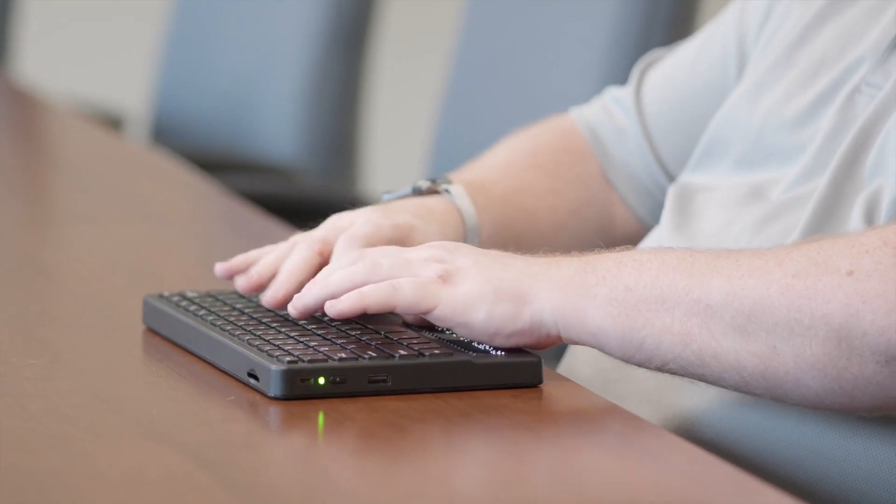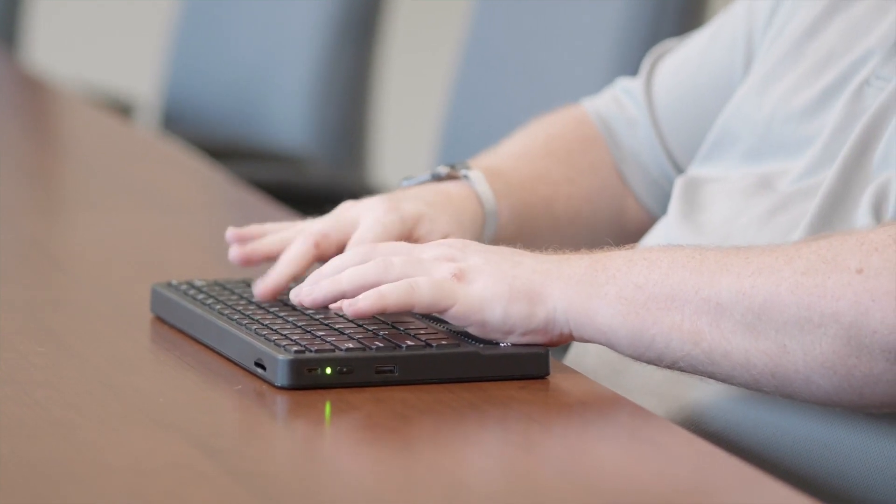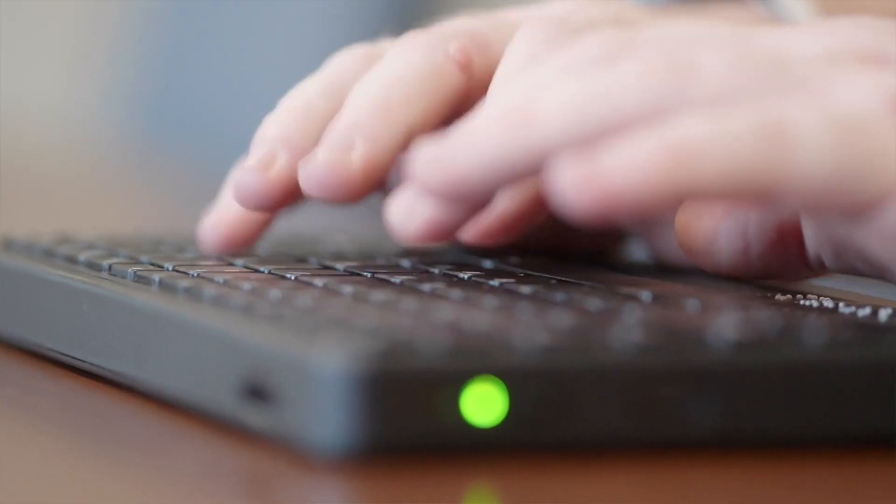Being able to use a QWERTY keyboard and type quickly and then have Braille right there — it's giving you those transferable skills that now transfer into higher education, into employment. This tool, the Mantis Q40, puts the Braille back under their fingertips in an all-in-one device so that they're typing on a keyboard and they're reading Braille.